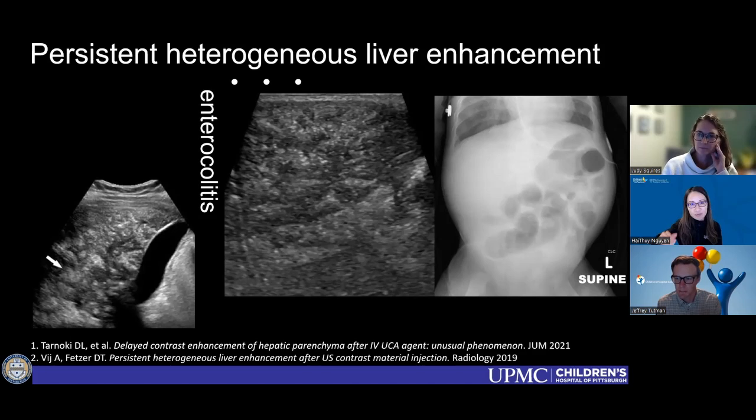But I don't have a specific cutoff, because the cutoffs themselves change depending on how fast you inject and what may occur within the tubing. So I feel like there's a little bit of variability with that. So I mainly look at the curves themselves.